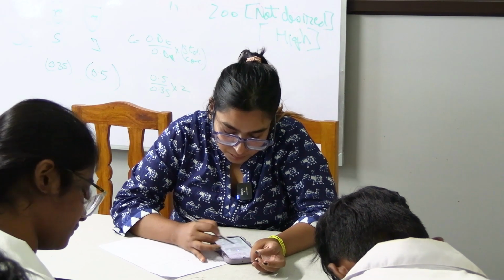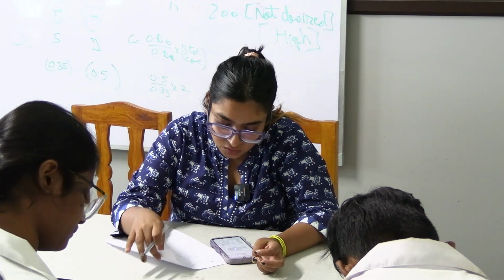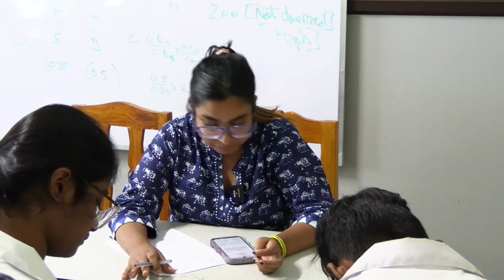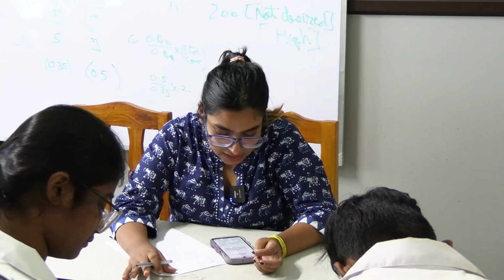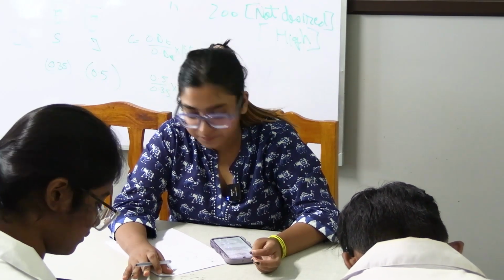High PCO2, within bracket you write respiratory acidosis, and high bicarbonate, within bracket you write metabolic alkalosis, as I already said and explained. More precisely, the patient is suffering from respiratory acidosis with compensatory metabolic alkalosis. You understood now? Okay.